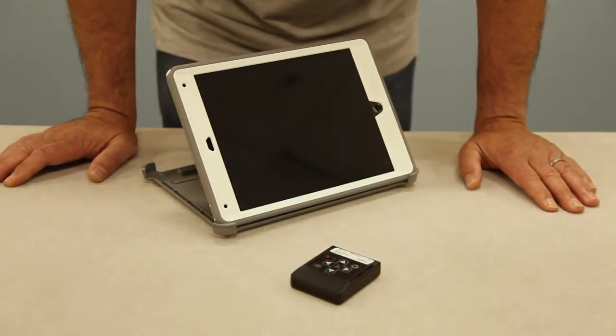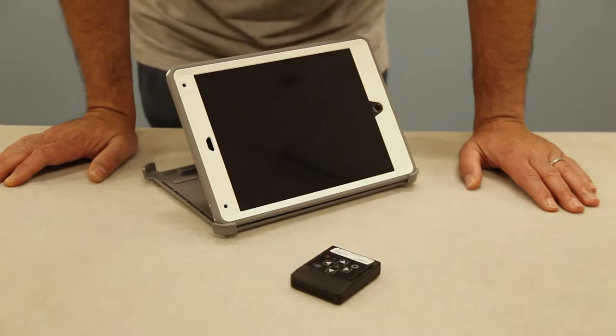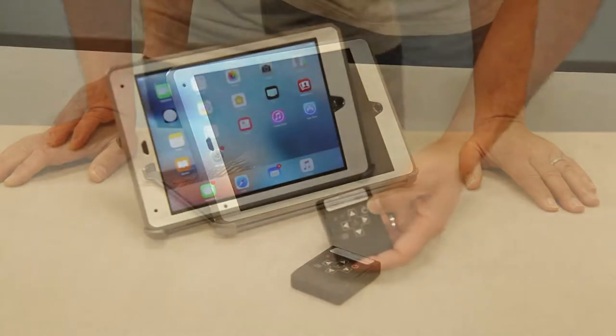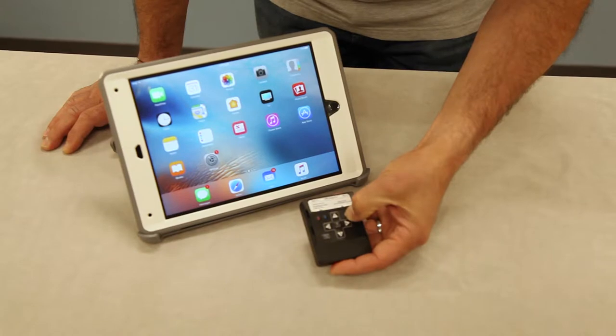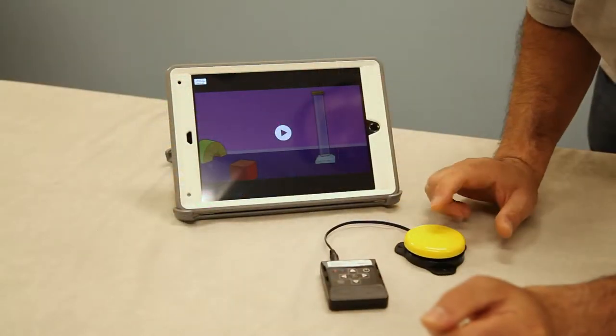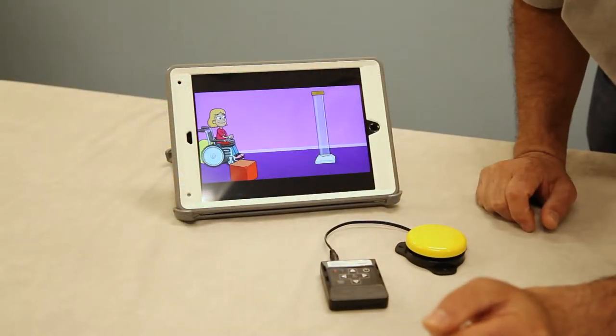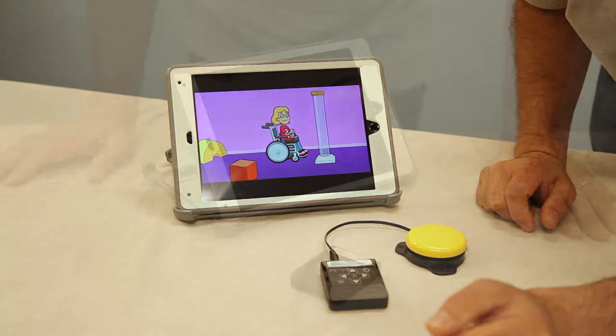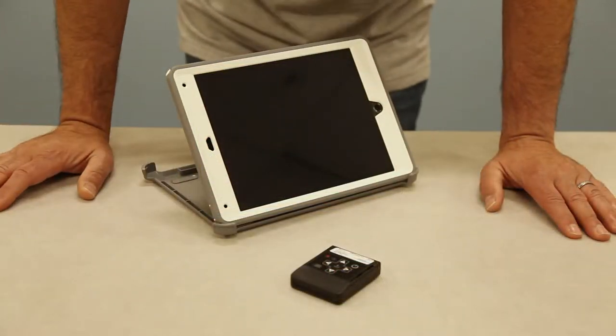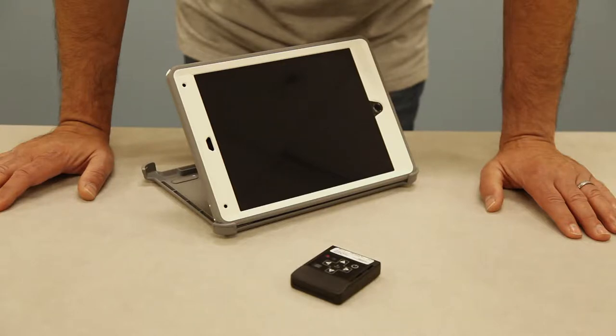This is our item number 1166 iPad wireless switch interface. This interface is a Bluetooth connected device which allows you to use between one and two switches with your iPad. Today I would like to show you how to set it up with the iPad and take you through a few assistive apps and also how you can control YouTube videos.